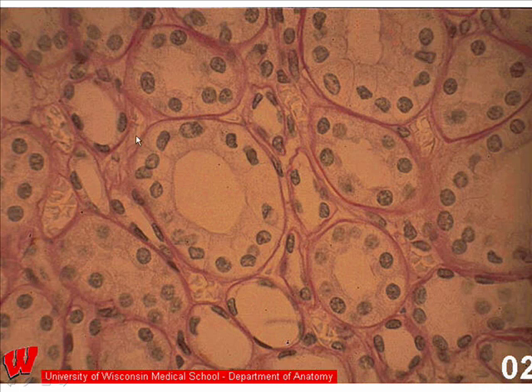What we're looking at are cross-sections of the tubules in the renal medulla in a kidney, and I don't want you to be concerned about that particular detail at this point because we'll study the renal system later. But this slide provides a very good example of all three types of simple epithelium.